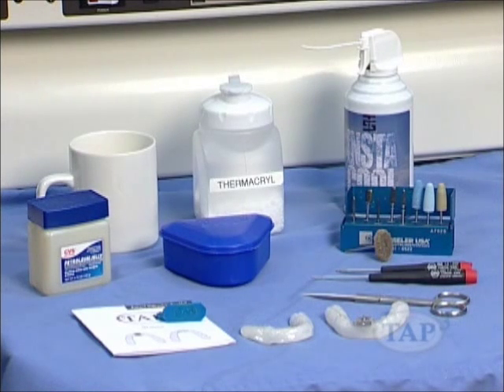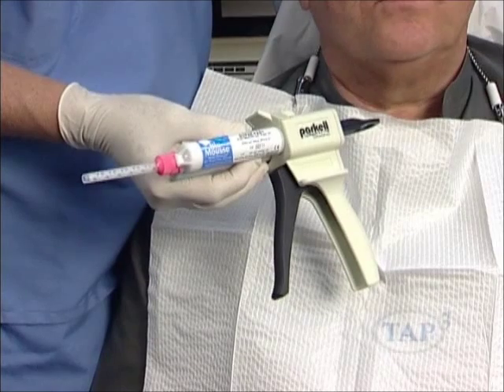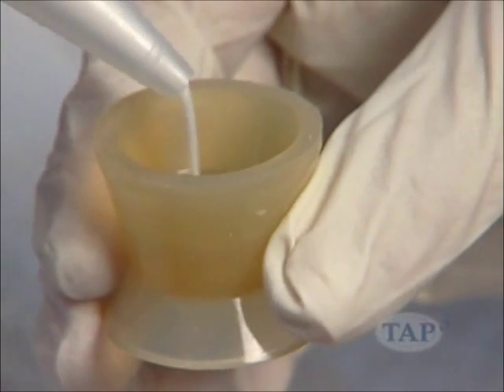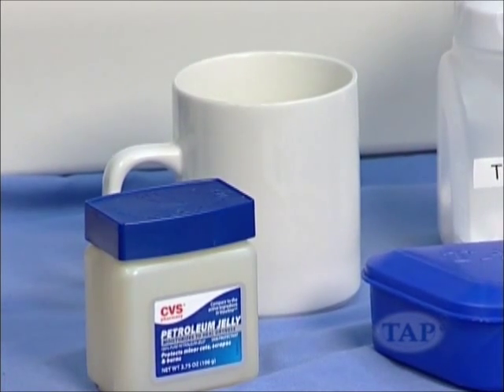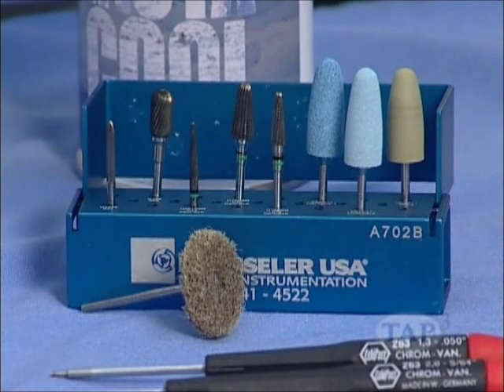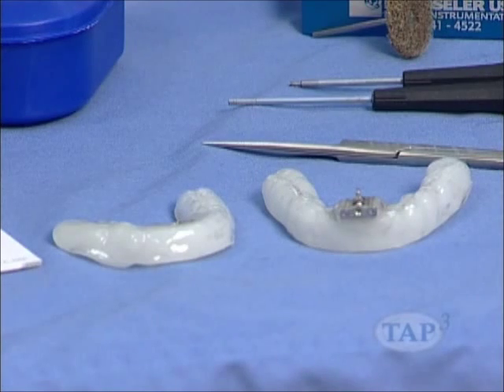The armamentarium to deliver the TAP 3 includes the following: a George gauge, thermocryl or blue mousse paste for the bite registration, cold cure acrylic, petroleum jelly, a cup of hot water for the thermocryl, a cup of warm water to cure the acrylic, Instacool, which is optional but will set the thermocryl faster, various burrs and polishing wheels, scissors, and the TAP and TAP accessories.